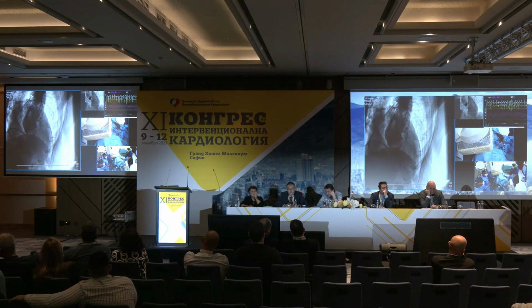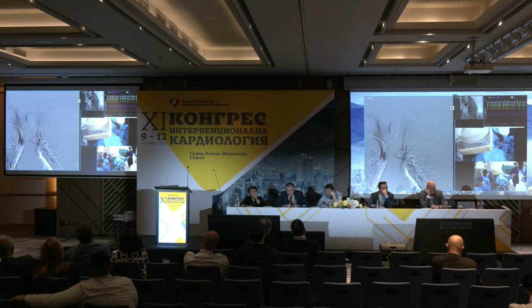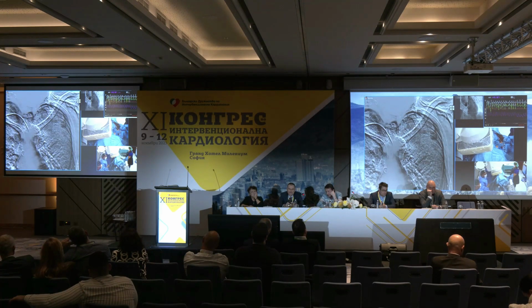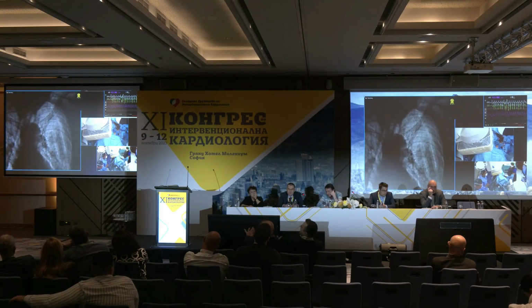The arterial pressure now is 150/90. The lady is absolutely stable, 100 of saturation, and there is a small detail. The small detail is probably you remember from the presentation that the lady had left anterior bundle branch block and right bundle branch block, so bifascicular. And after the implantation, we were definitely very, very happy with that. We saw a short period of asystole. It was like a cold shower.